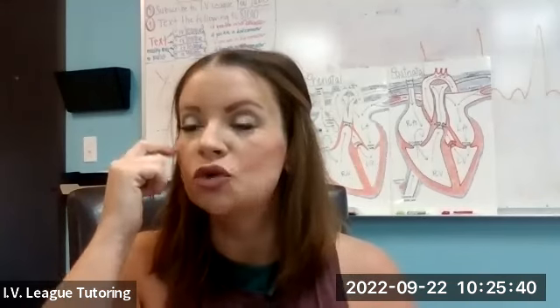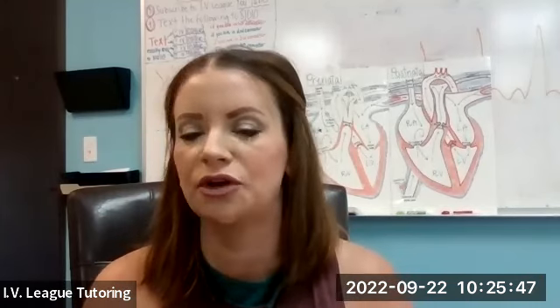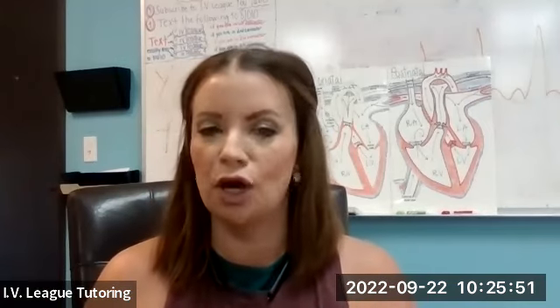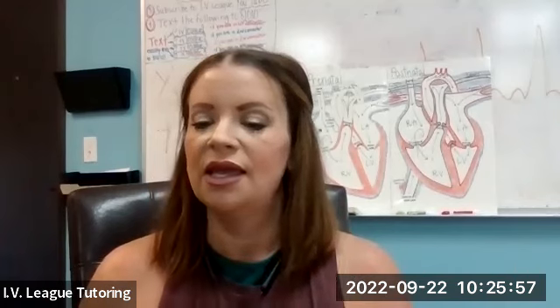Yes. Okay. So in order to say that an EKG is normal, we're going to go through a checklist. Y'all can turn your papers over for this, so you can make sure that you go through each of these for every EKG. Number one: is the heart rate 60 to 100? That's the first thing you're going to do. So you need to calculate the heart rate first using your 6-second strip. Got that?